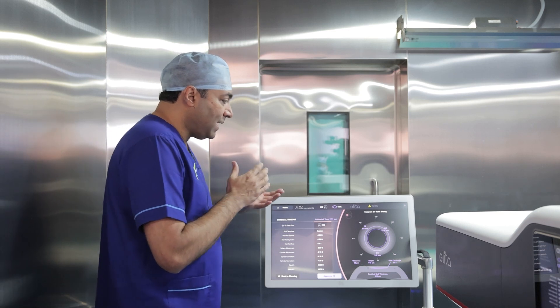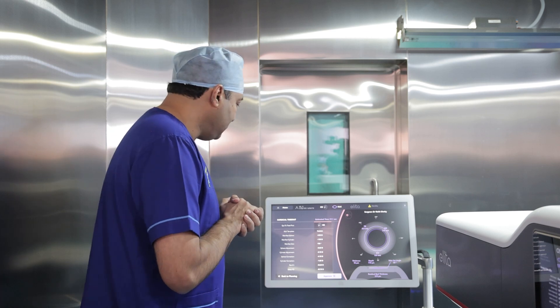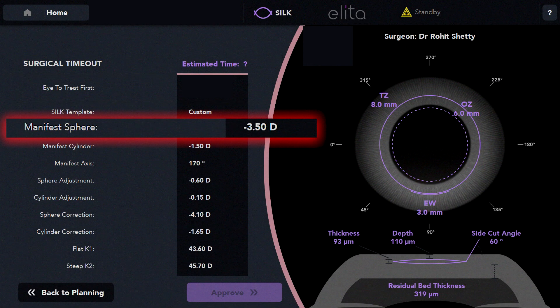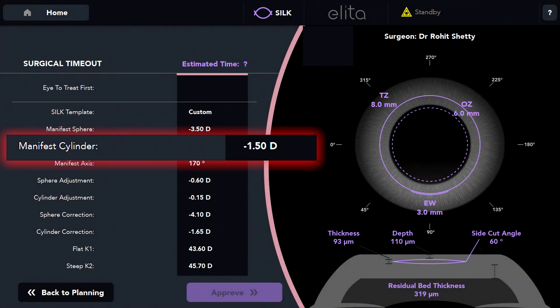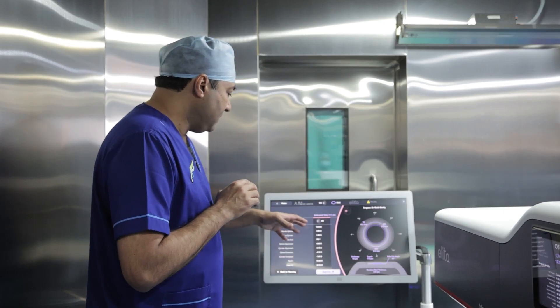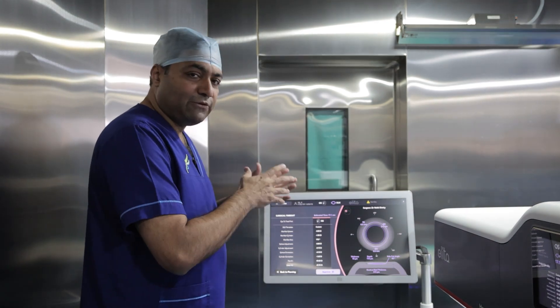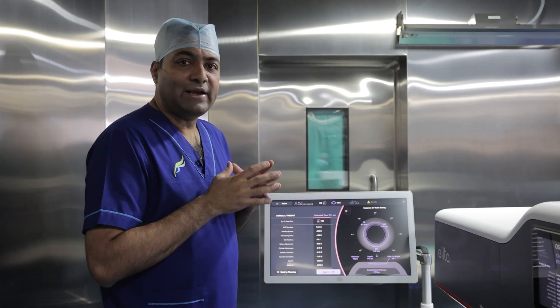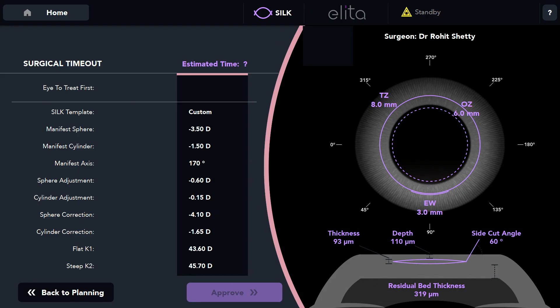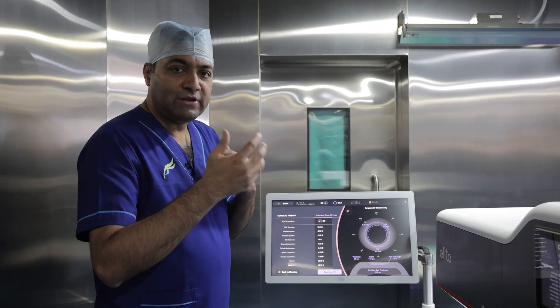Let me start off with my patient today. This is a 32-year-old young girl who wants refractive surgery. She has a correction of three and a half diopters with one and a half diopters of cylinder at 170 degrees. We have done work close to 400 eyes as part of a trial where we demonstrated that we need to do a small nomogram adjustment in our geographical population, and we can use whatever nomogram you want here so that this will help in the final correction.